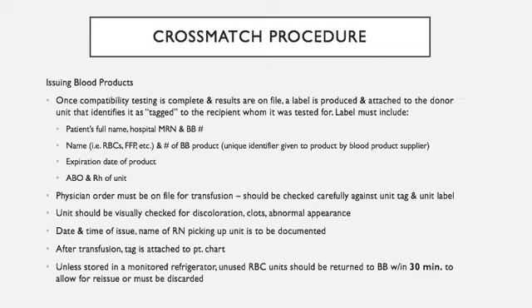We also have to check the unit visually just to make sure that nothing looks weird about it. Is it discolored? Are you seeing clots? Just anything that looks weird about that unit. We also have to note the date and time that we issue that unit and the name of the nurse that's picking up the unit. We have to document that. After the transfusion is complete, the tag that we had on that unit with all of the patient's information then gets attached to the patient's chart.